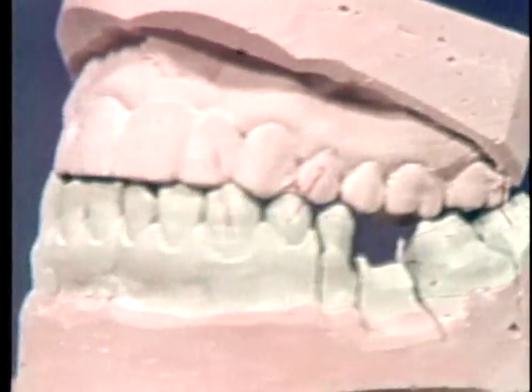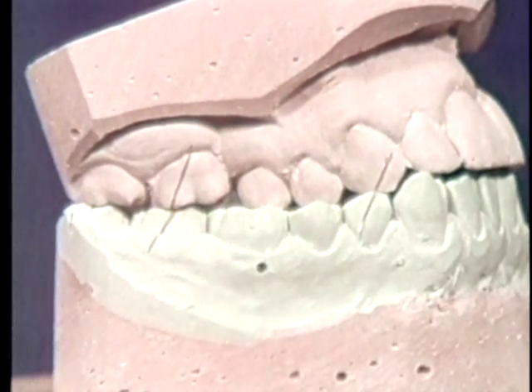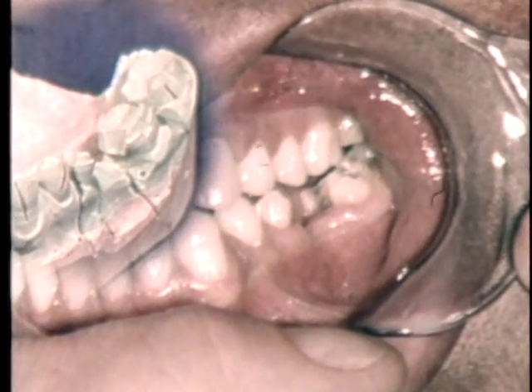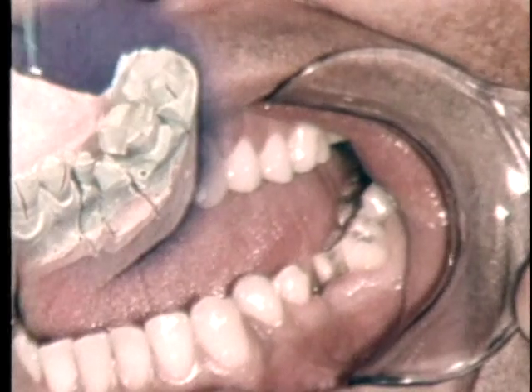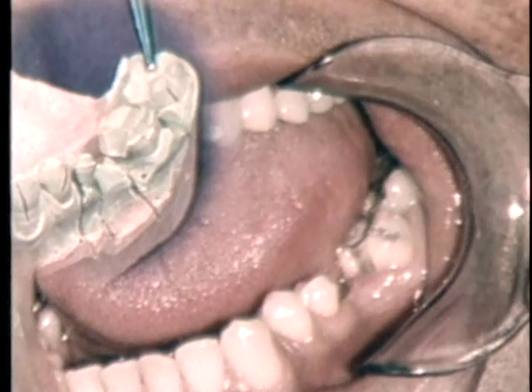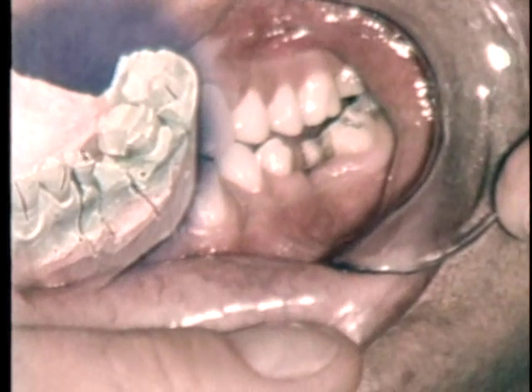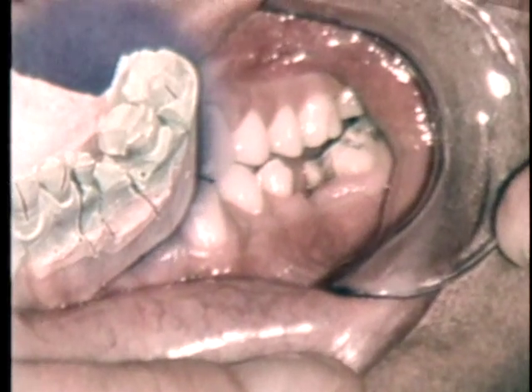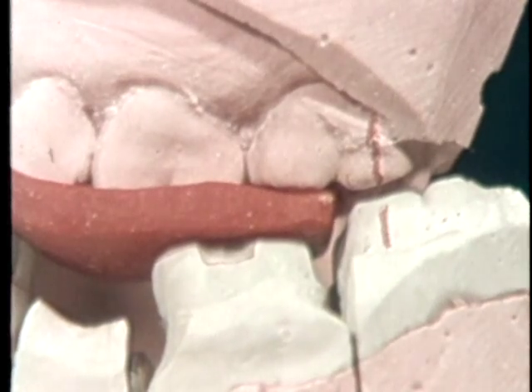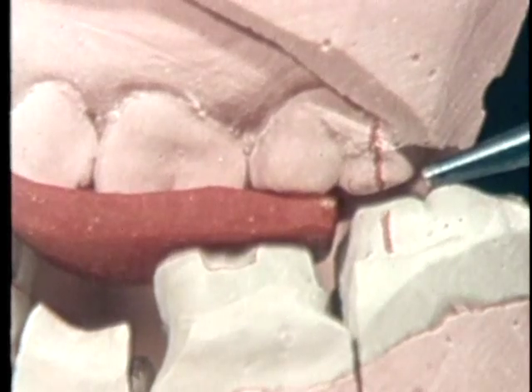It is only necessary to use witness lines or cuts to record centric occlusion at tooth contact. Here a mandibular three-unit bridge has been prepared. An unprepared molar lies distal to the terminal abutment; subsequently, no jaw relation record is needed. The majority of fixed prosthodontic cases fall into this category. To introduce a jaw relation record when not indicated is courting the introduction of errors.